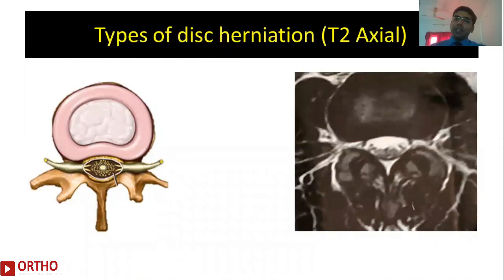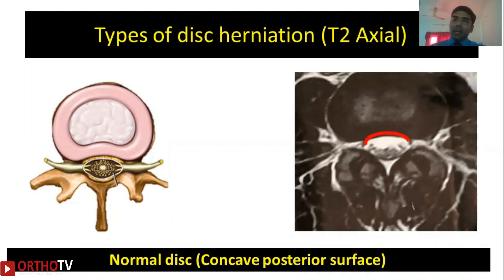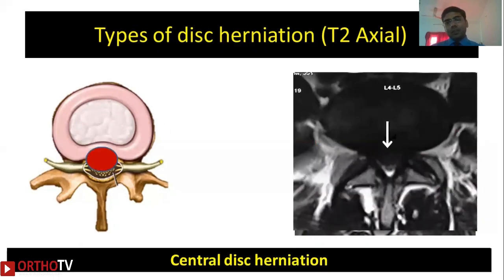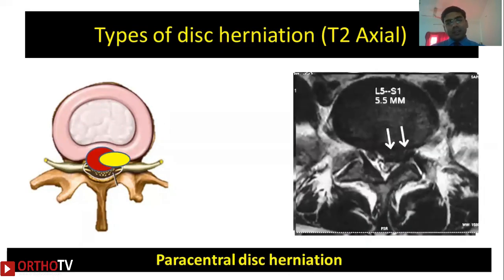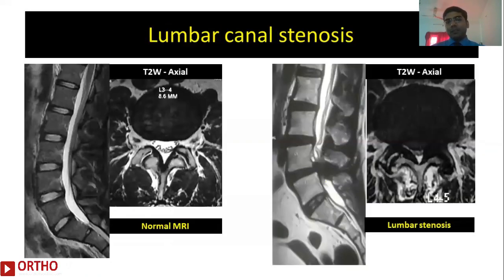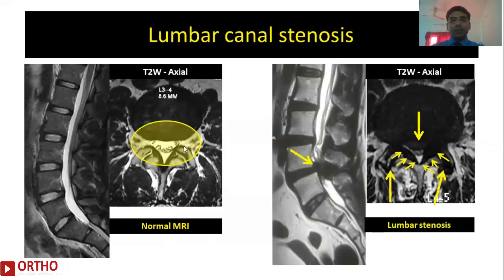On the T2-weighted axial image, the posterior surface of the disc is usually concave, and when it loses its concavity and becomes convex it is reported as a disc bulge, which may or may not be of clinical significance. Clinically significant findings include a central disc herniation, paracentral herniation, foraminal herniation, or extra-foraminal herniation. Apart from disc pathologies, stenosis from degenerative changes giving rise to claudication can also be identified on MRI. On the left you can see the dural sac and nerve roots lying freely, whereas on the right, because of the herniated disc and ligamentum flavum hypertrophy, there is significant compression and clumping of the nerve roots.